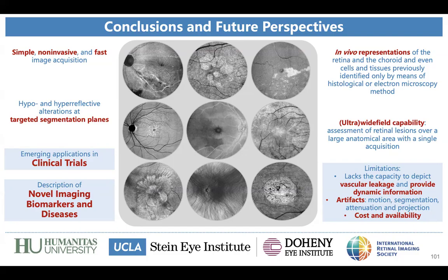I don't know if you agree with me. I don't know a standalone technique for evaluating any retinal disease, grading it and helping us make the right choice for treatment. And one thing that I think we should be aware of, for whoever is watching and wants to apply it tomorrow.